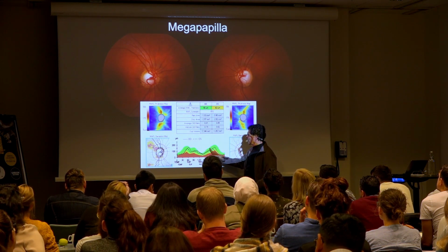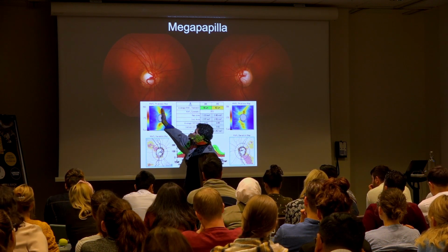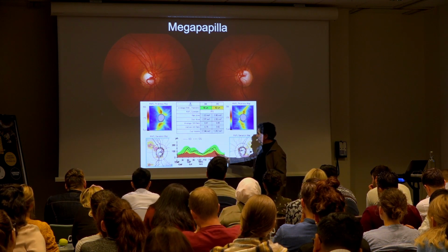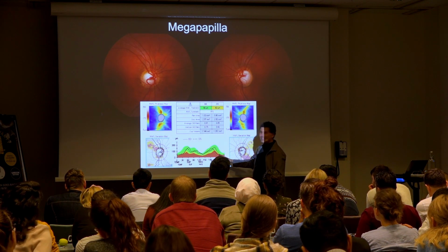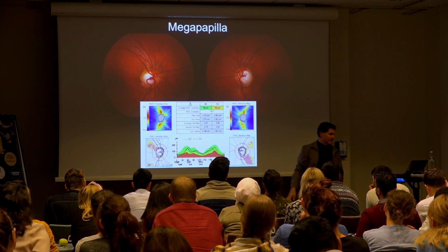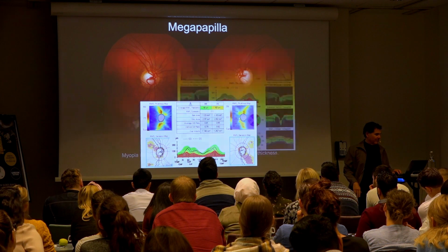If the peaks are shifted inwards, that means the arcuate is coming in vertical. It's shifting, and that's why you get this coming into the red range. If that peak was in the normal location, you wouldn't have it. So people call this red disease because they refer to glaucoma, and it's really an artifact of their axial eye length.